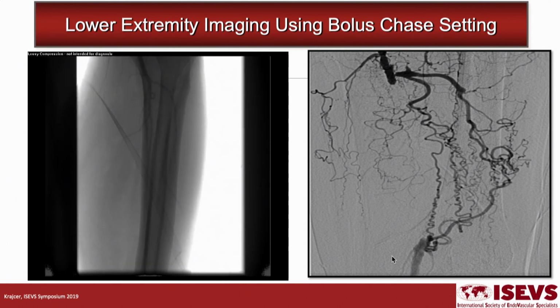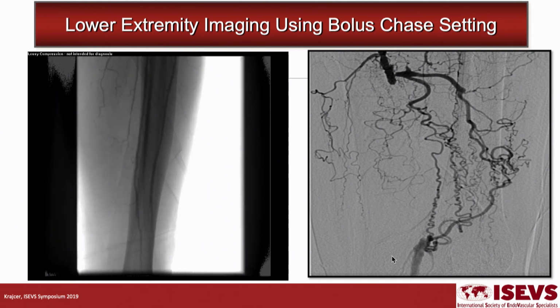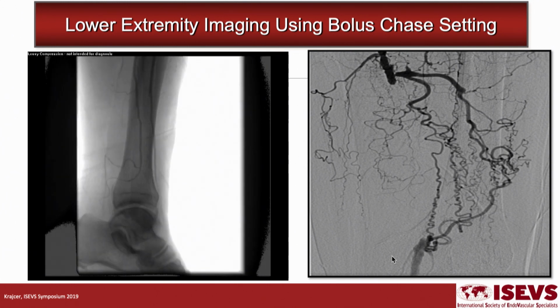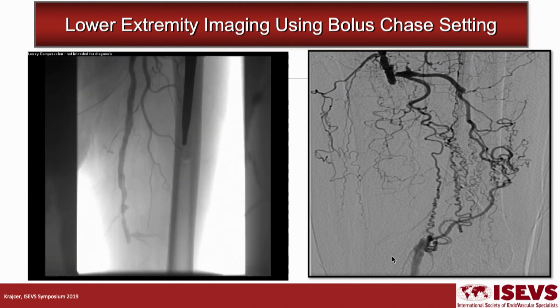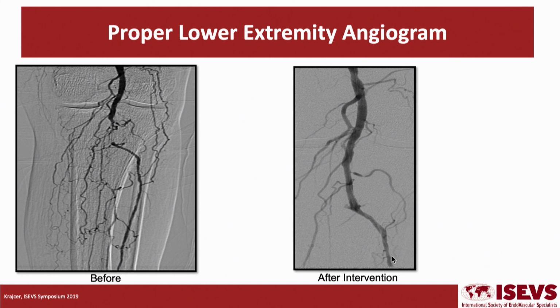Now, for adequate imaging during the intervention, we have to define the anatomy clearly, and we will use a still frame, as you can see here on the right-hand side, to identify if this particular lesion is the most appropriate for intervention or surgery. In this particular patient, we can see very abundant collateral network. However, this patient had significant symptoms and the intervention was performed.